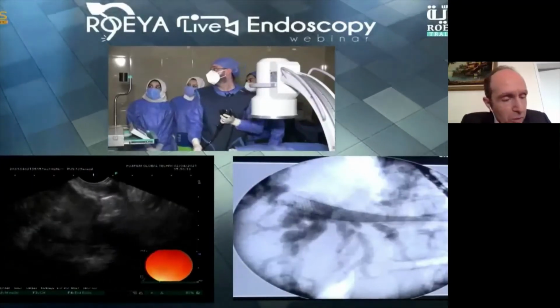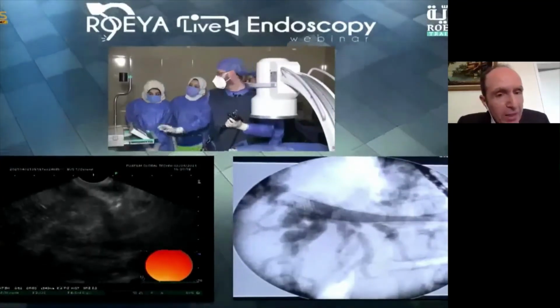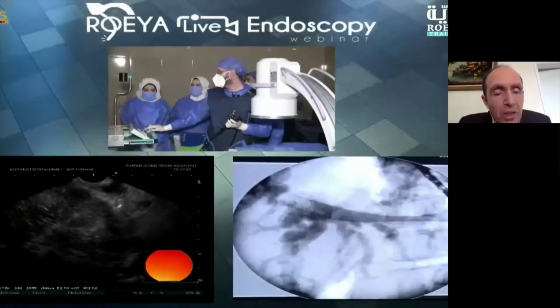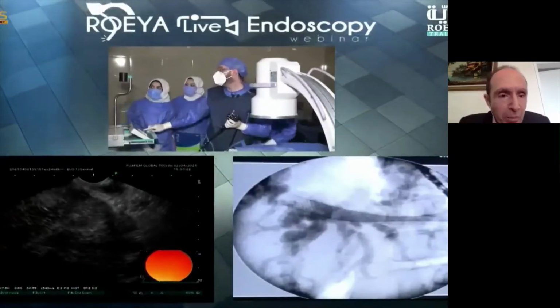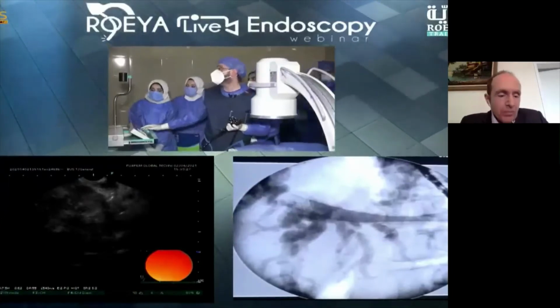So, Professor Altonbary, we've been told that we need to end the session. Maybe you could show us what you're planning to do for FNB, which needle, how many passes, and then we can end the session. Okay, this is the last step.